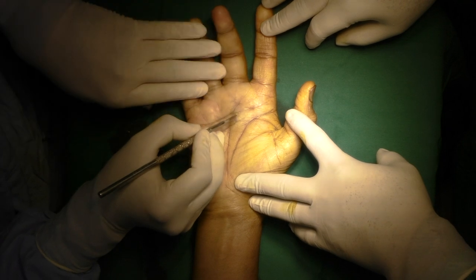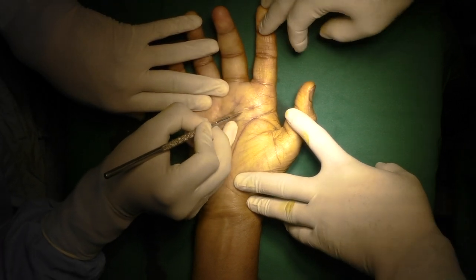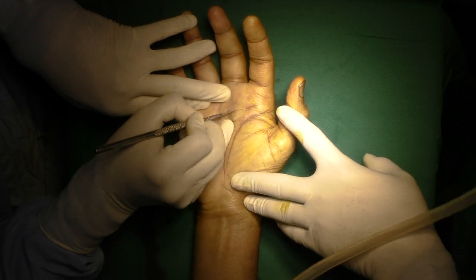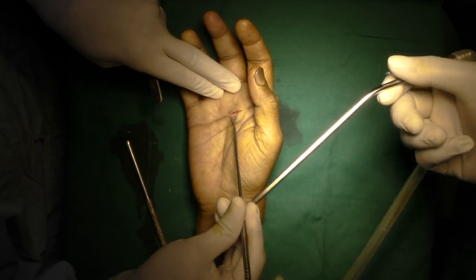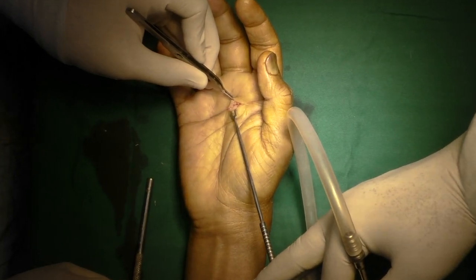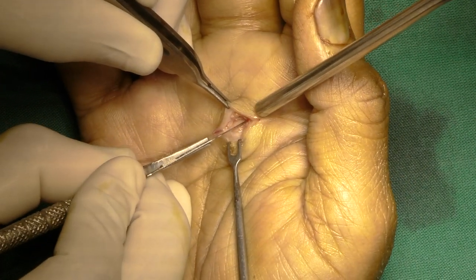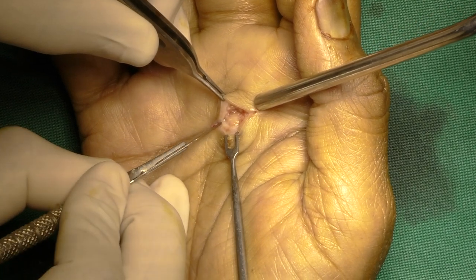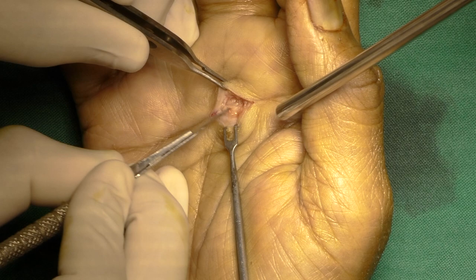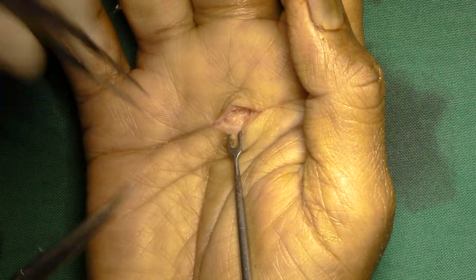Incision taken with a number 15 blade in the palmar crease. After initial gentle spreading of tissues with blade under magnification, flexor sheath was visualized and dissected with tenotomy scissors. Frank pus came out immediately.